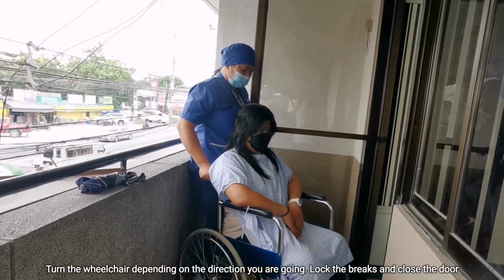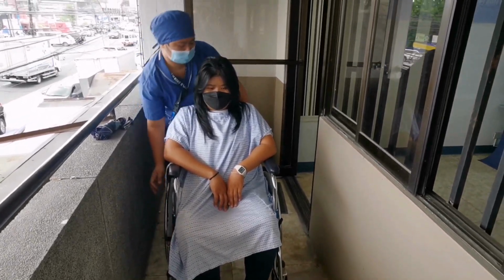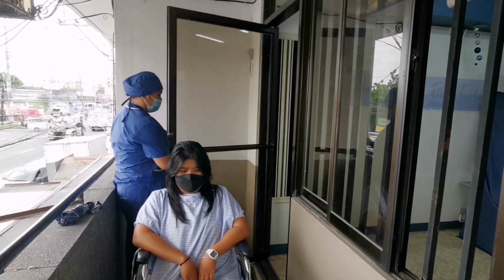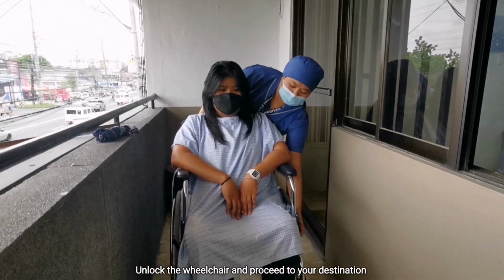Turn the wheelchair depending on the direction you are going. Lock the brakes and close the door. Unlock the wheelchair and proceed to your destination.